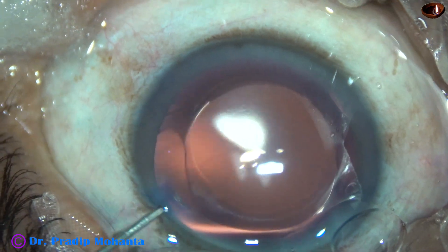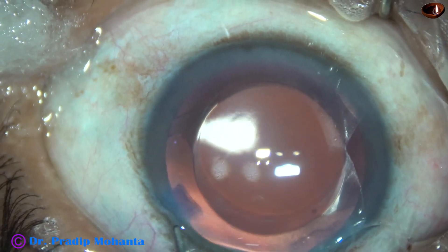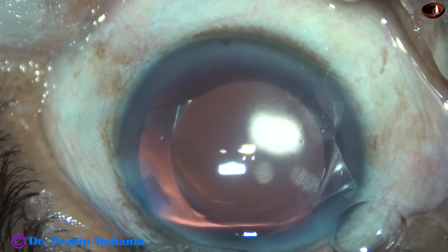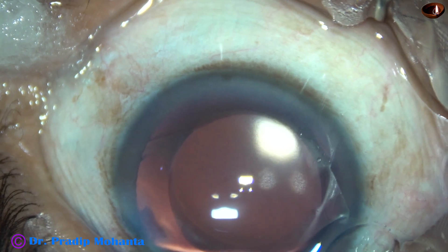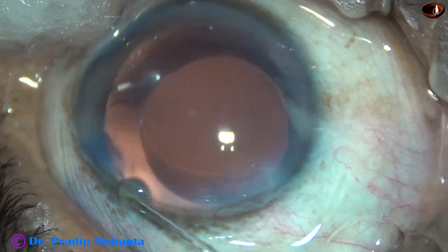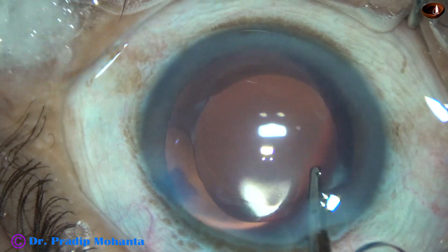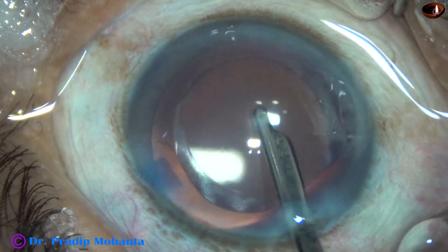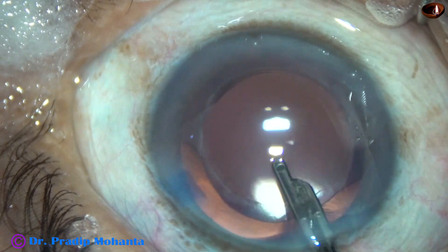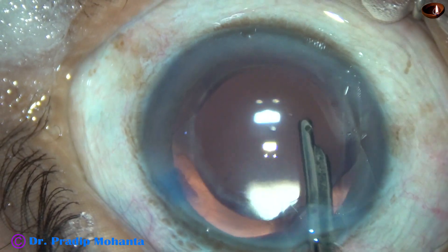We are towards the end of the surgery. We haven't used the right side port during irrigation and aspiration of the visco, so I am hydrating only the left side port. The right side port has had a lot of rest and doesn't need hydration. The main wound has been constructed so it will not require any hydration. This is the final lavage of the anterior chamber with the 23G Simcoe cannula.